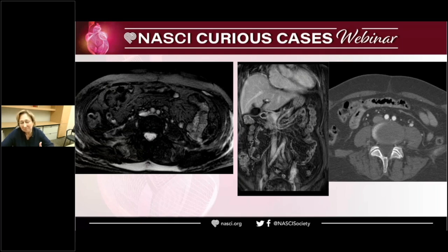We came up, so actually I did call the cardiologist, and first of all, I asked what side the axis was, and I was told that was the left-sided axis, right? And then measured the size of this tiny left common iliac vein was 4 millimeter max, I believe, and it was diffusely narrowed here behind the right common iliac artery, and you can see that on this coronal images as well.